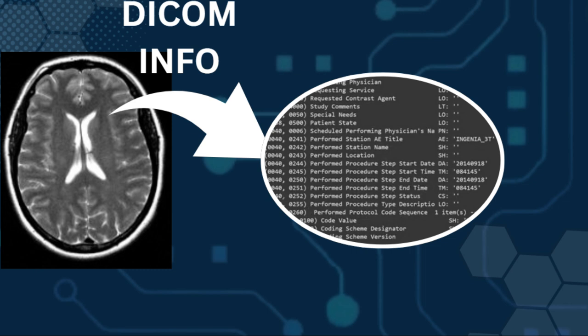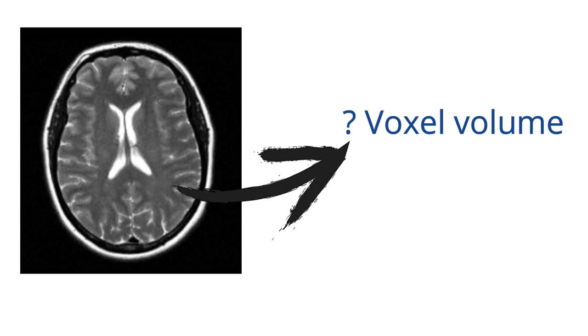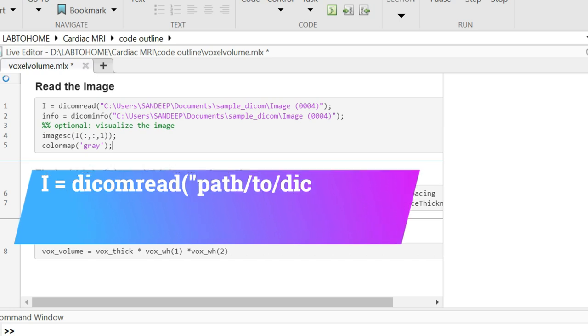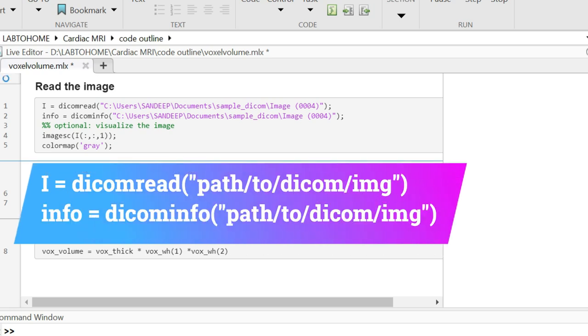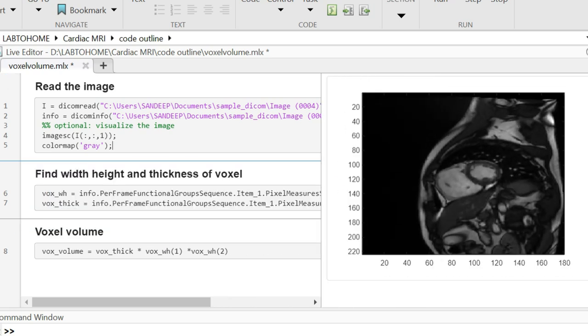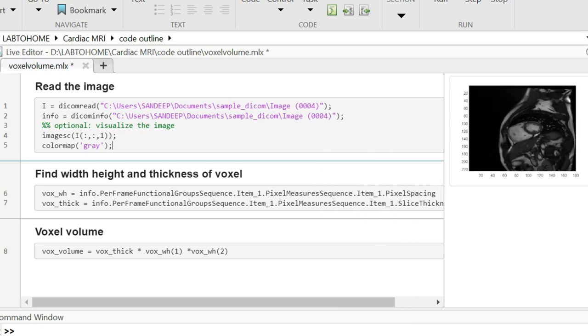Let us see how we can find the voxel volume from DICOM images in MATLAB. First we read the DICOM image using DICOM read function. We can visualize it just to be sure it's the correct image.